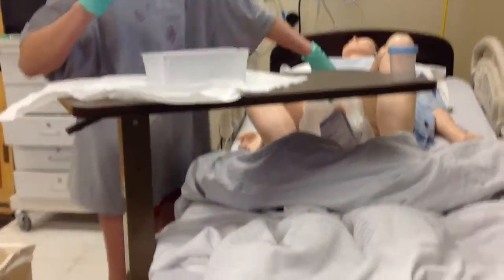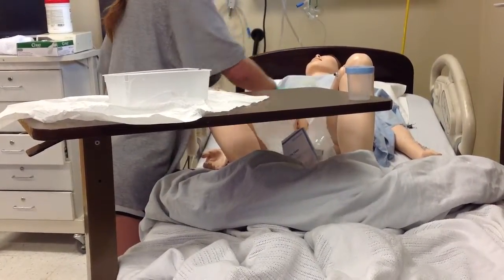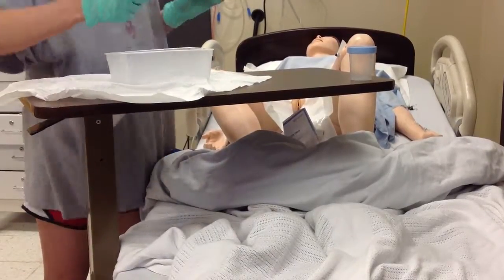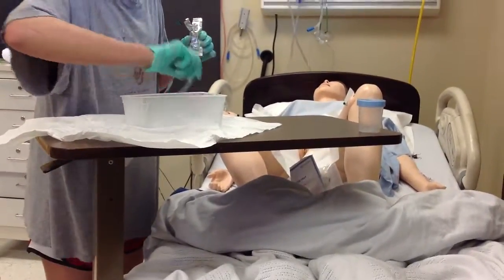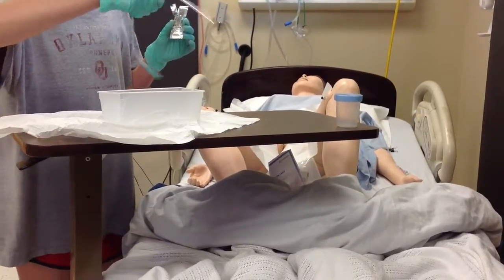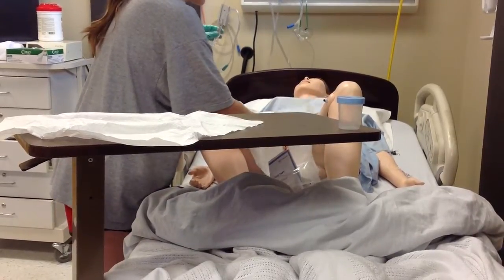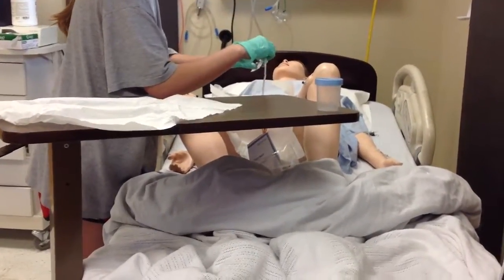I'm going to use my non-dominant hand and clean the left side with one swab, then clean the right side with one swab, and clean down the middle. Now my non-dominant hand is no longer sterile. I'm going to insert the catheter into the lube. The catheter touched my hand so that wouldn't be sterile — I would get a new one. Mrs. Smith, now we're going to get started. Do you have any questions before we begin? Nope.